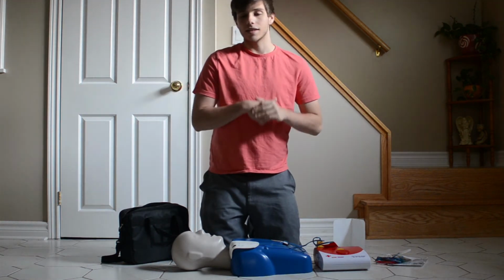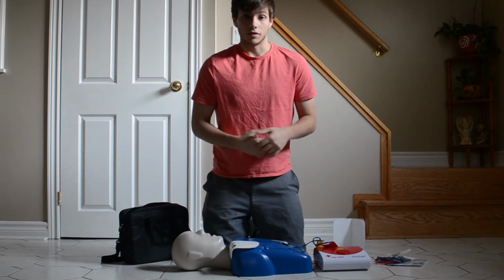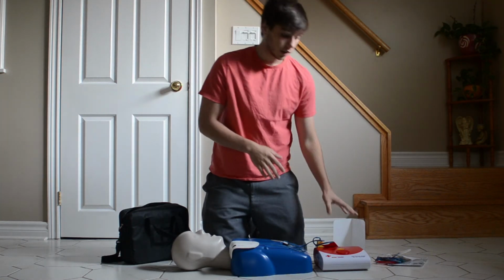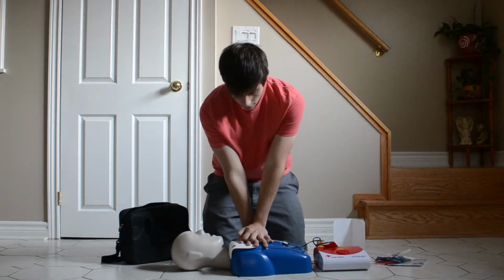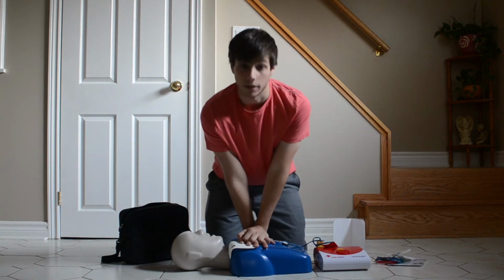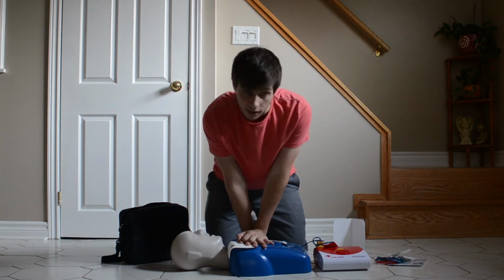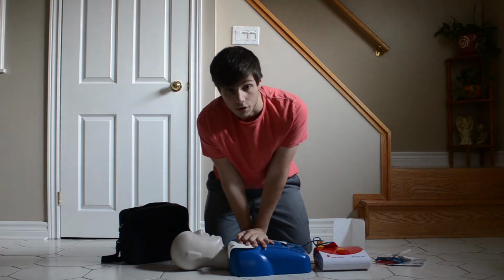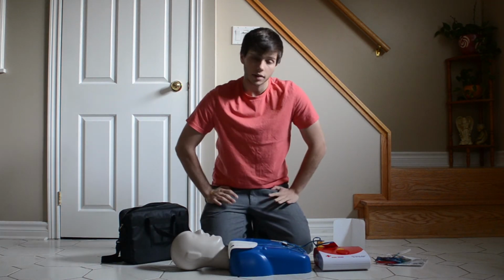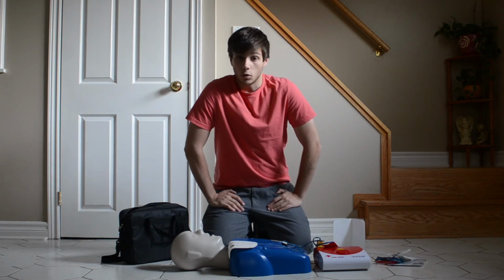If in this case it says shock advised, you're going to want to get back on there as soon as it instructs you, because it's going to be charging the shock that it's going to deliver. So you want to get back on and continue your CPR, 30 to 2. It says shock charged, please administer shock. At this point you want to step back and move away from your patient, and make sure that no one else is touching the patient.